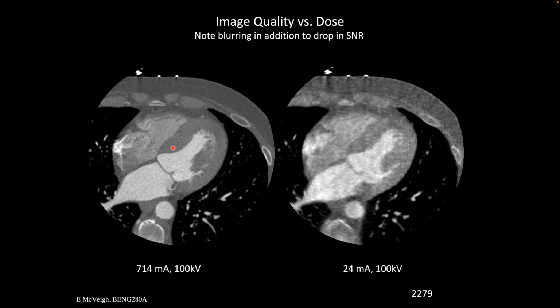Because if you do MRI just out in space like this, you get tons of marine band traffic and stuff like that in RF. So in CT, you basically just plop it in a small room and you have to have enough concrete or some other material that absorbs X-rays so that there are no X-rays escaping from the room, but that's not expensive.